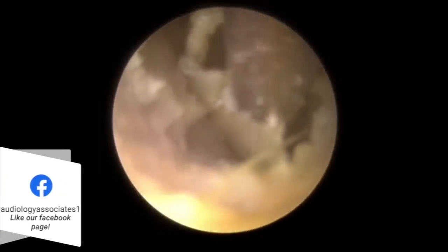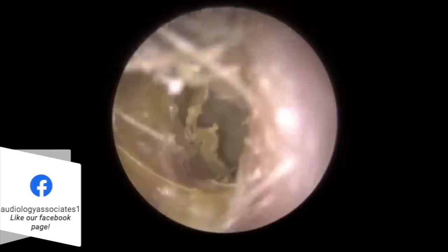Unfortunately for this patient, it's built up really deep in the canal. Not only has it covered the canal walls, but it's gone as a thick layer up and over the eardrum as well, really restricting the movement of the eardrum and dampening that sound. The patient is having quite a few problems with their hearing on this one side, apart from it being really itchy and annoying. You can see we're starting to peel those layers away — you can see the spores on top, followed by the thinner mushier layer, and then the thicker layer at the bottom.